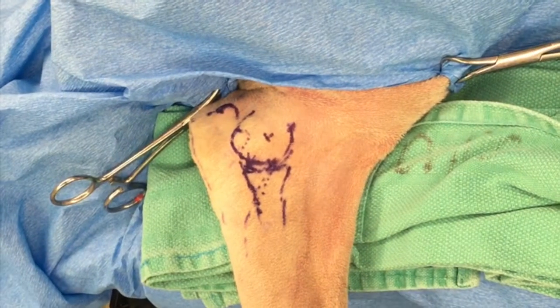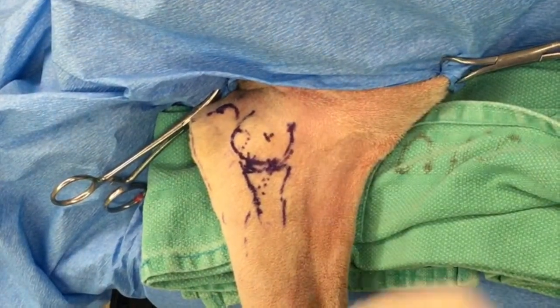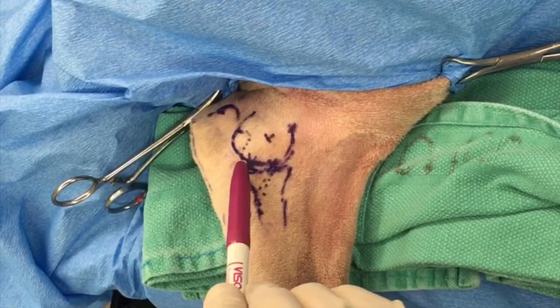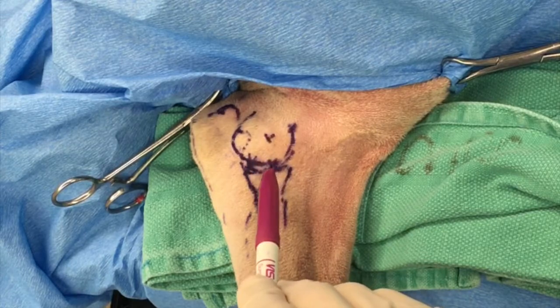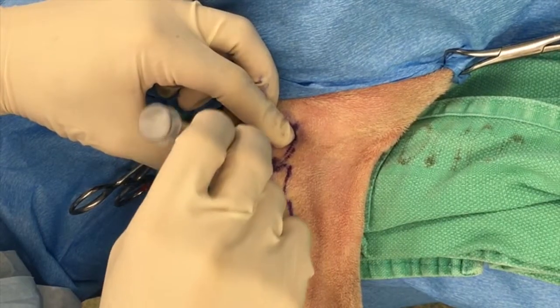Elbow arthroscopy is performed in lateral recumbency with the affected side down. Landmarks are drawn out, with the medial epicondyle being the most important, along with the radius and ulna. The scope portal is approximately 1cm distal and caudal to the epicondyle, and the instrument port is 1cm cranial to the scope port.